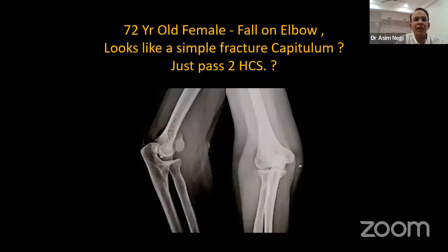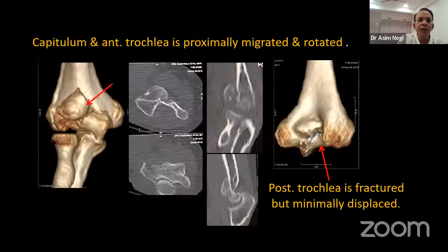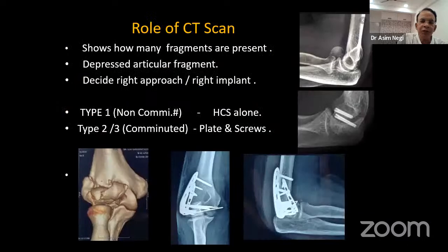A 72-year-old female had a fall on elbow. What looks like a simple fracture of the capitulum, and the surgeon may think that he has to just pass two headless compression screws. On a CT scan, it was found to be a very comminuted fracture of capitulum and anterior part of the trochlea, both proximally migrated and rotated. I think CT is mandatory to treat any intra-articular fracture at any joint level. It will show you how many fragments are present. Are there any depressed articular fragments? It will help to decide the right approach and the right implant.